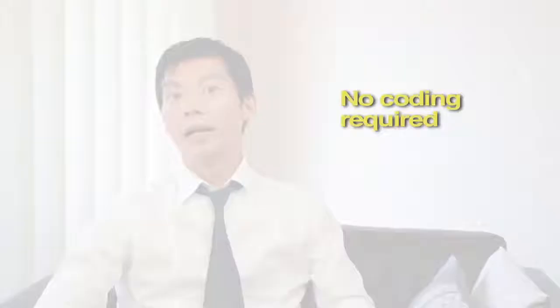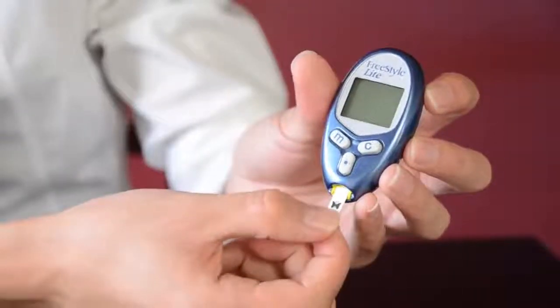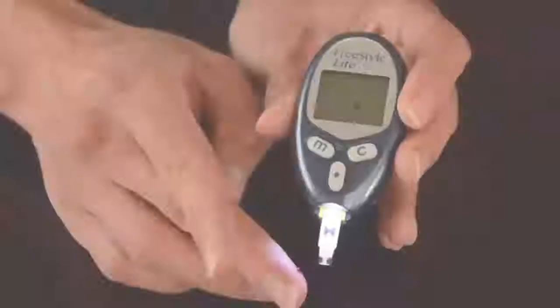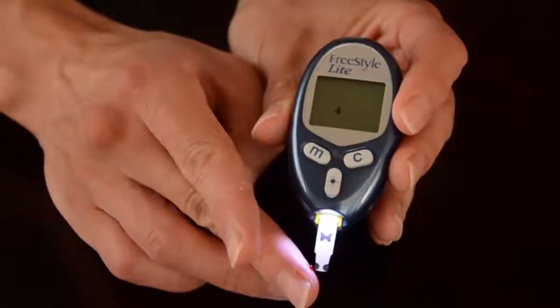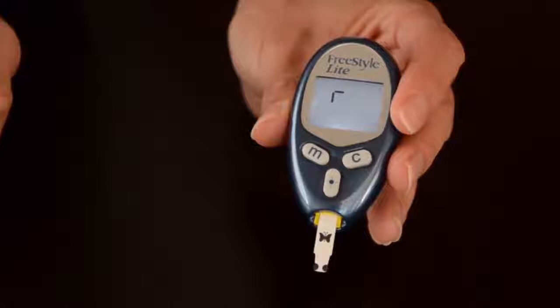No coding is required. Basically the meter is ready to go — all you have to do is insert the test strip and perform a blood test. This meter has two lights so that you can test at night time. It has a screen light and the other lights up the test strip area. This function would be handy if you need to test in dark conditions such as inside your car at night time or if you're out camping.